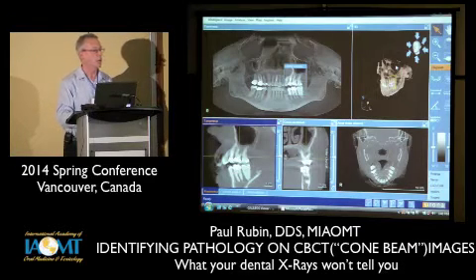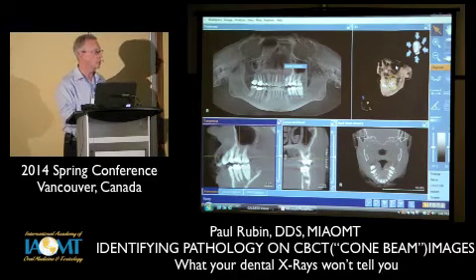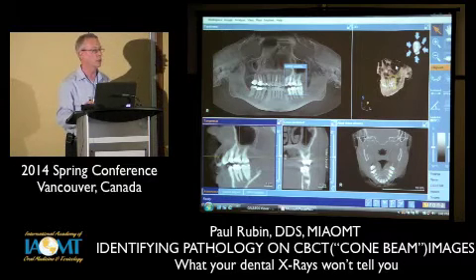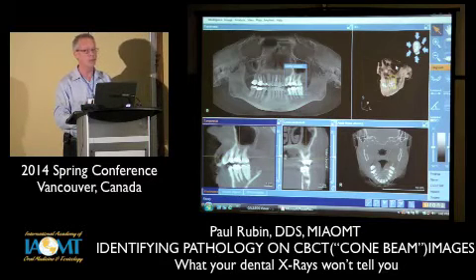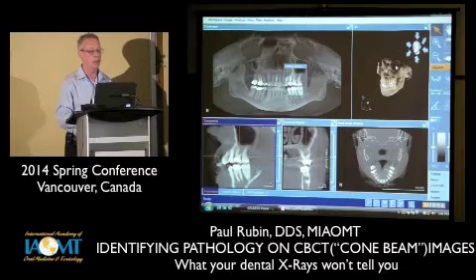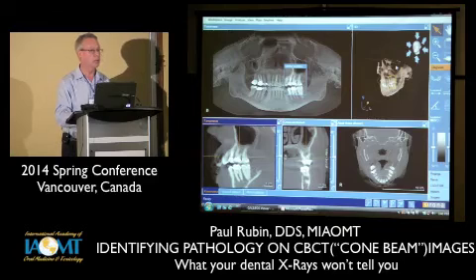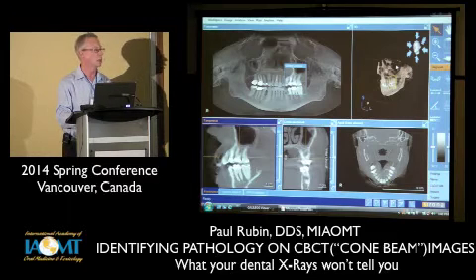I tell them radiographically it looks fine, but here are some other reasons why root canals that may look perfect on an x-ray may not be so perfect. And I run through the whole rigmarole of what we know about root canals. So to me, there's sort of two levels. There's a real obvious level of a radiographic failure, and then there's the fact of, it's a dead tooth and all the issues surrounding that. So I won't get more into that. I'm just surprised at how many clearly radiographic failures I'm seeing on these images that I never saw on panoramic or periapical images.